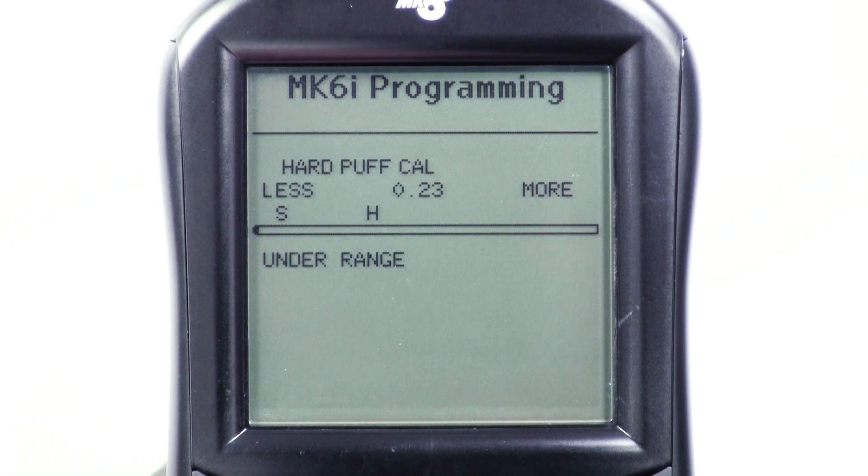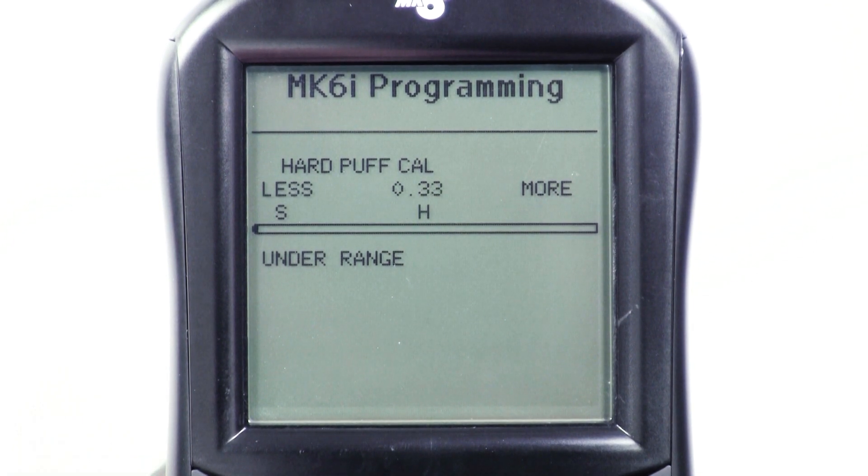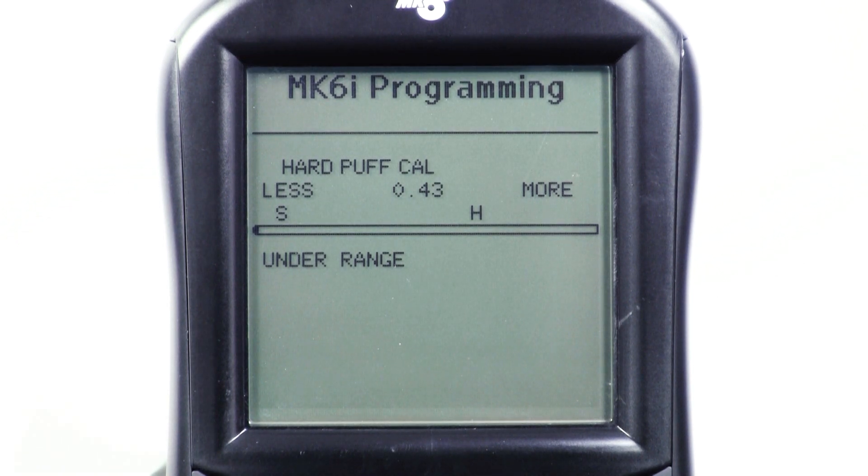Use the up or down arrows of the handheld programmer to move the H value close to where the user was able to reach. Ask the user to puff hard again to check for consistency in reaching the set level.